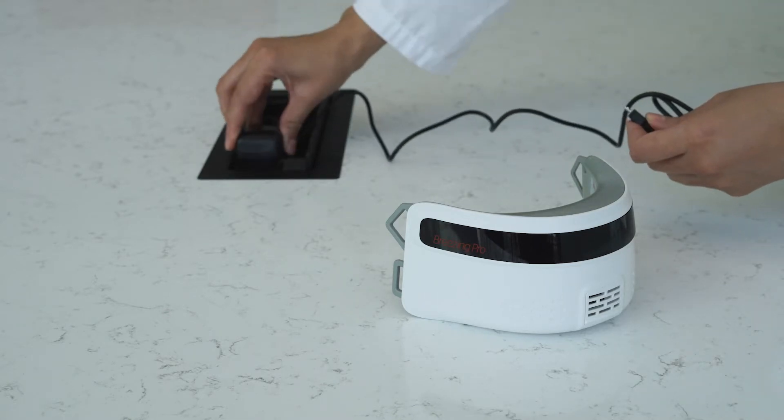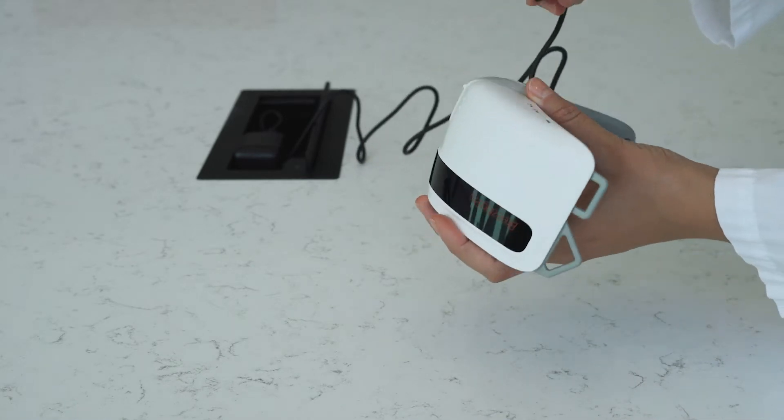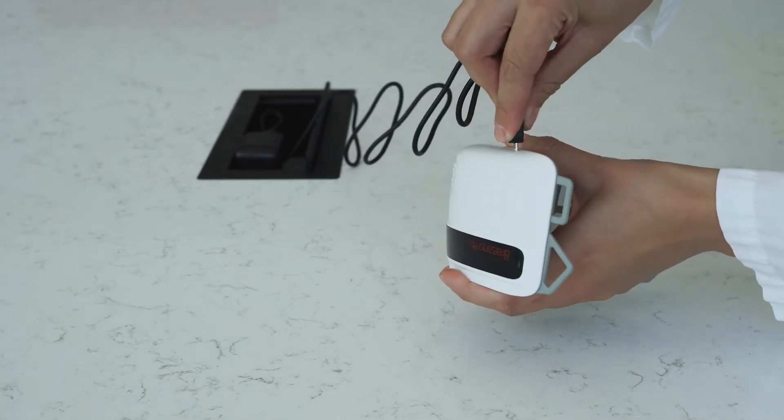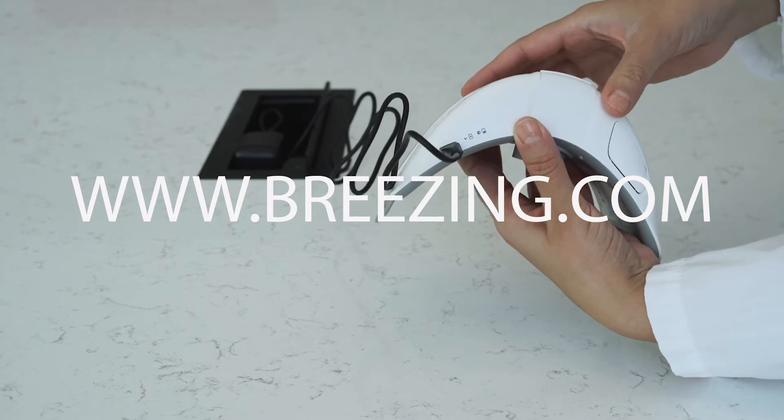It is important that the Breezing device is fully charged before use. You can charge it overnight before use. Also, it is important to disinfect the Breezing device every time before use, following the Breezing Disinfection protocol from our user manual.